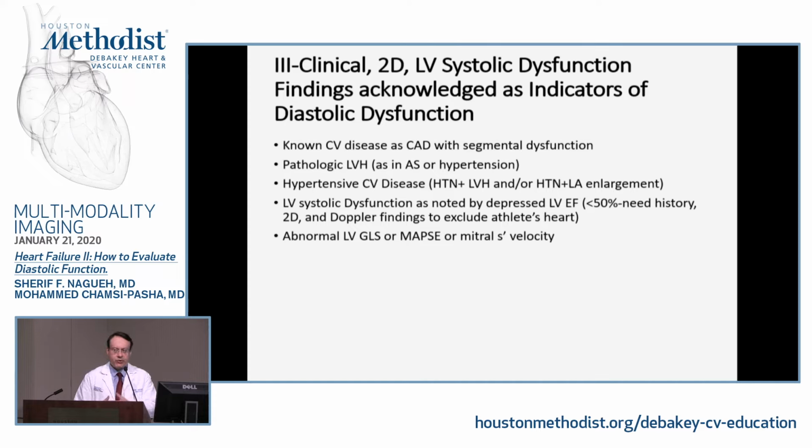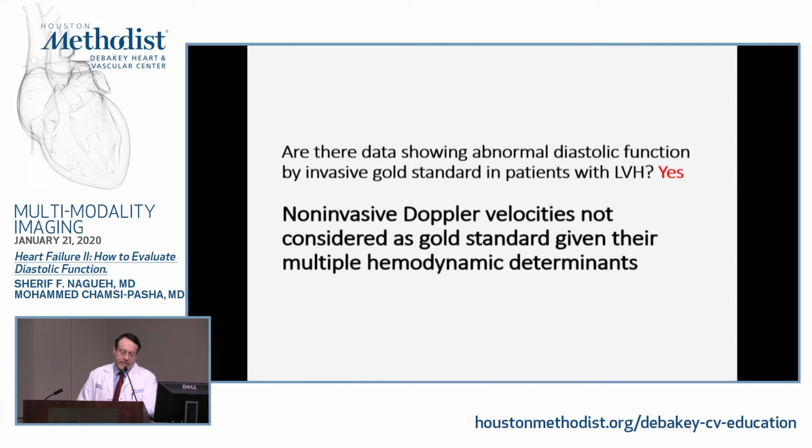And as we were talking earlier, when you evaluate cardiac function, no element of cardiac function is looked at by itself in isolation. Everything is in the context of the whole study. And so it's important to look at systolic function, not just EF, but also long axis function, as with global strain and mitral annular descent indices, be it the absolute descent or the S prime velocity.